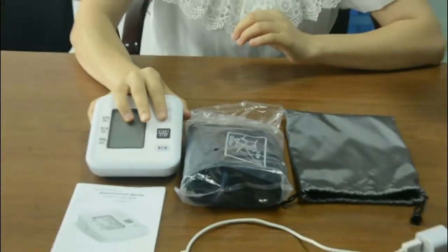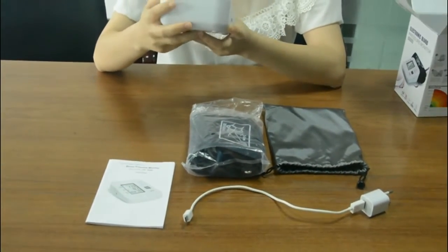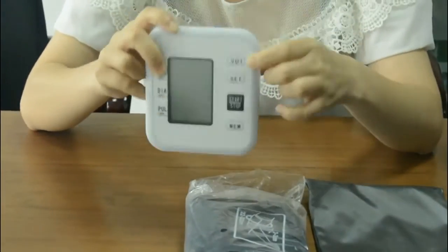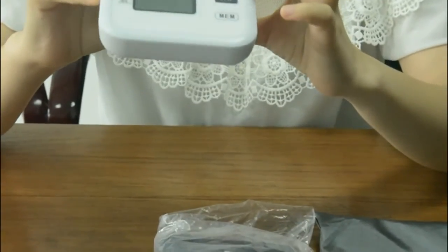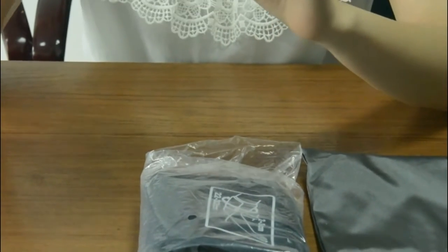Let me show you how to use it. First I want to show you the key functions on the device. This one is the voice key, this is the volume key, this one is the set key, this one is the power on and off key, and this one is the menu.